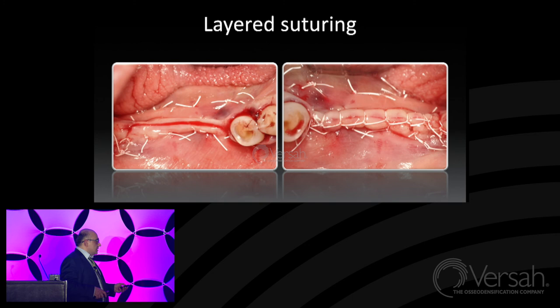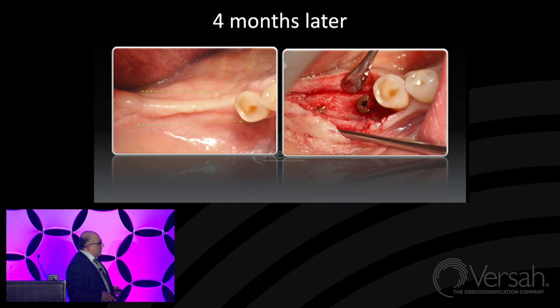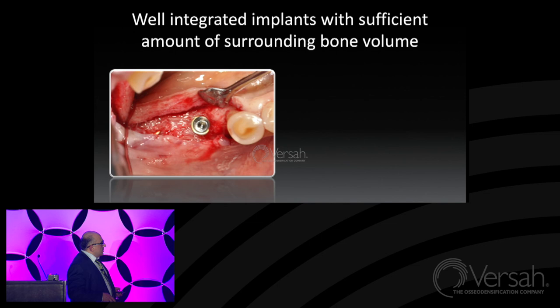So 4 months later, we return, and look at this. Look at the new amount of bone around the implant. Here it is. The second one is fully covered.